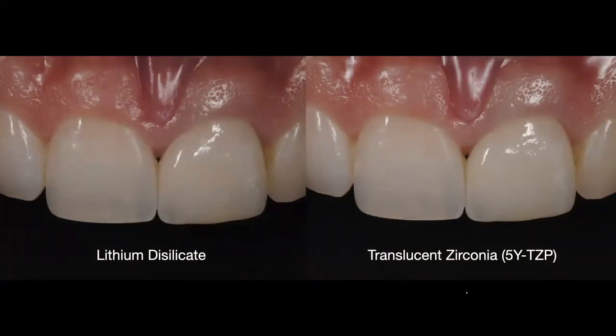And they told me, we're going to send you 2 restorations. We're going to fabricate one in lithium disilicate. And this is the one that I really wanted, because I knew the capabilities. I know the capabilities of light transmission through the lithium disilicate compared to the zirconia restorations. And I'll take a black and white photo there as well, just to share with you.